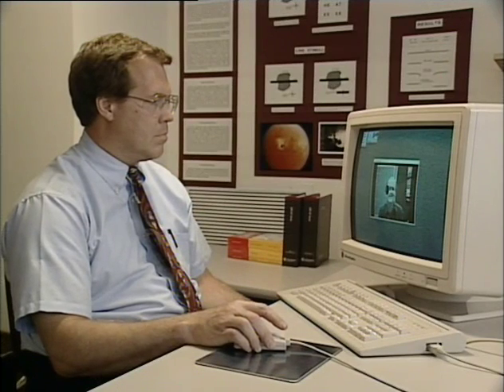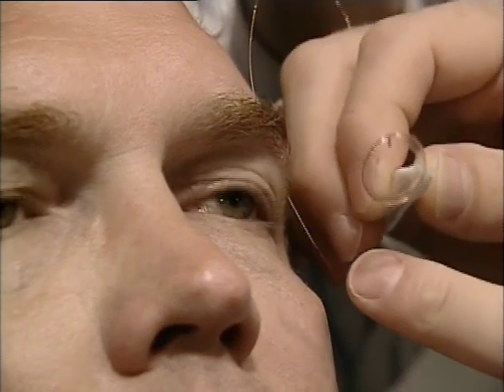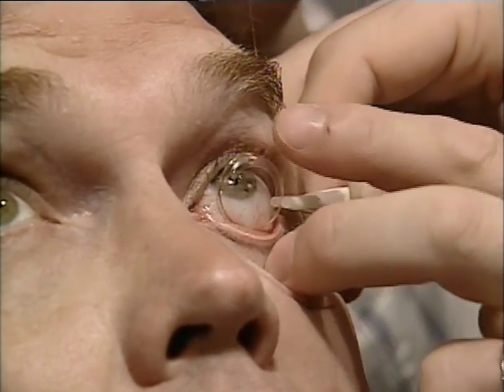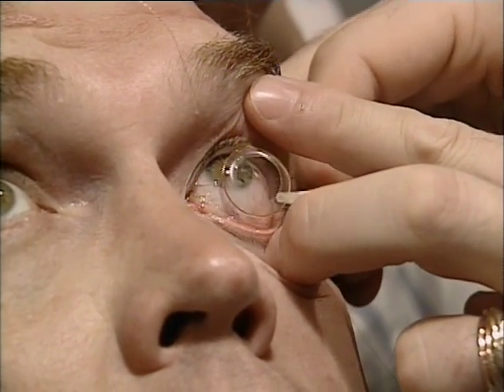His computer takes the part of the scene that the eye can't see and pushes it out to where the eye can see it. The result is distorted. But then the brain constructs its own distorted view of that. Those distortions will cancel each other out, and the patient should see a completely seamless image with no missing information and no distortions. But to make this work in practice, the computer has to know where the eye is looking.